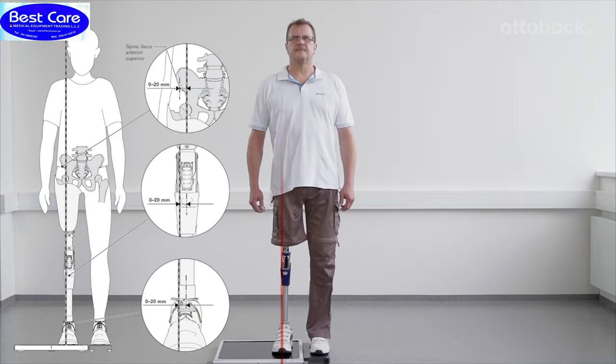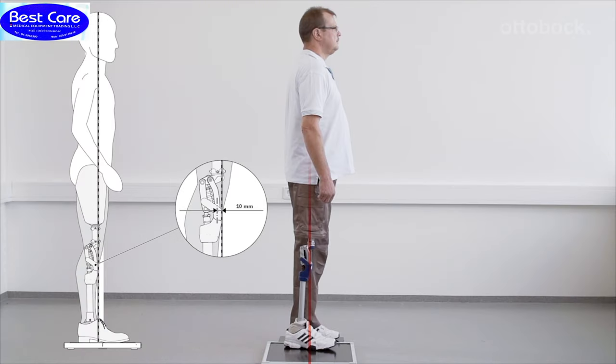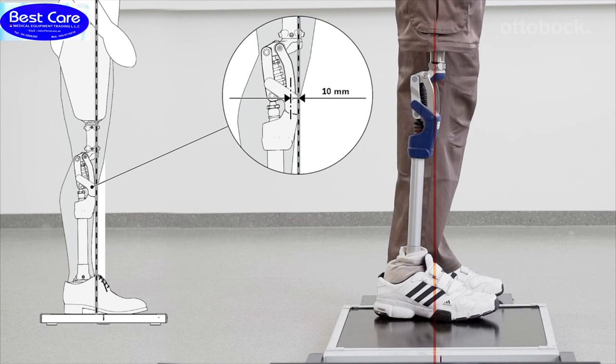In the frontal plane, the alignment reference line runs through the middle of the prosthetic foot, the middle to outer edge of the knee, and the middle of the socket. The sagittal plane alignment should now be adjusted solely by changing plantar flexion so that the load line runs about 10 millimeters anterior to the knee axis.